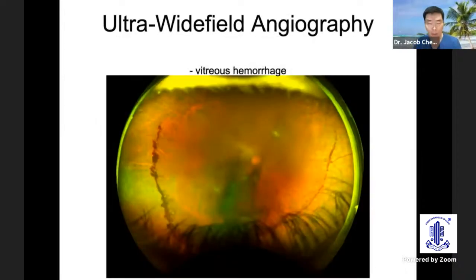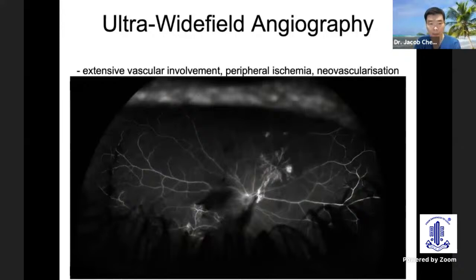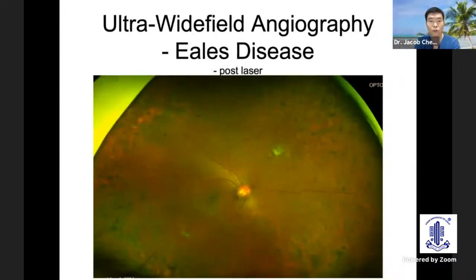This last patient is probably more typical in your part of the world. The patient presented with vitreous hemorrhage. You can see some lasers applied to the periphery and some remnant vitreous hemorrhage. Here, with extensive vascular involvement, peripheral ischemia and new vessels, this will go for a diagnosis of Eales disease, confirmed on the fluorescein angiogram. And just to document with the ultra-wide field, the pre-retinal hemorrhage from the new vessels at the superior nasal areas, as well as the extensive nasal laser that has been applied.